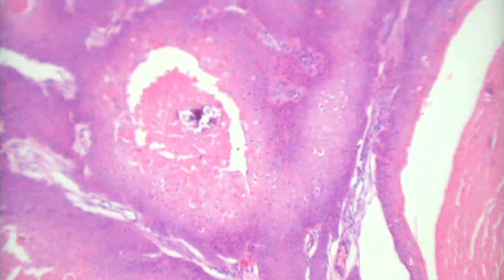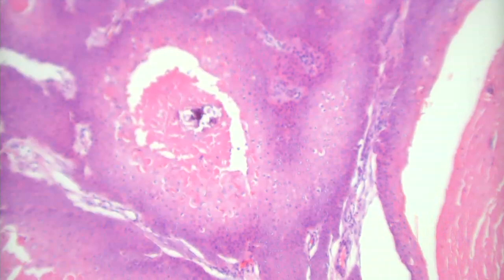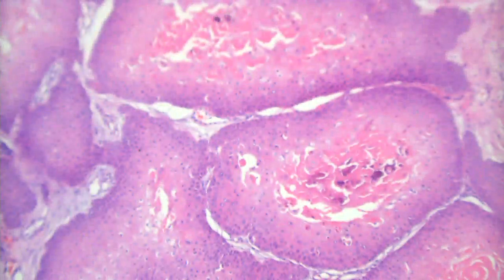The other thing you do when you get something really large is look at the individual aggregations. Let's pretend this is the whole thing. Well, this little thing is small, symmetrical, and well circumscribed. It doesn't have any mitotic figures. So you take individual aggregations and put them together, and lo and behold, you get a benign process comprised of multiple small benign aggregations.